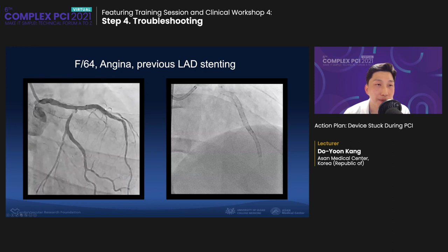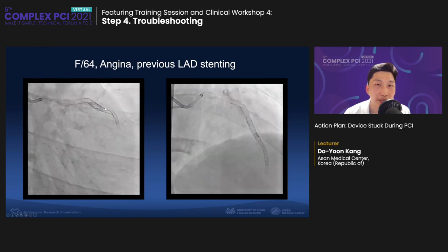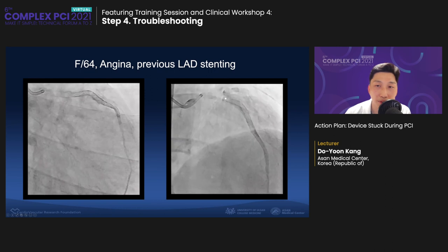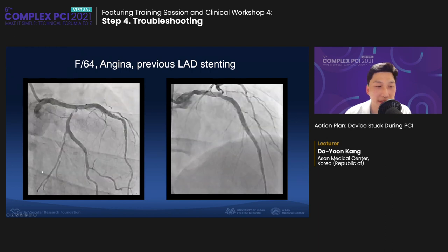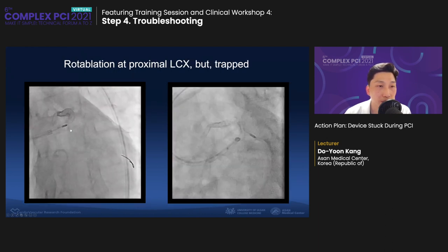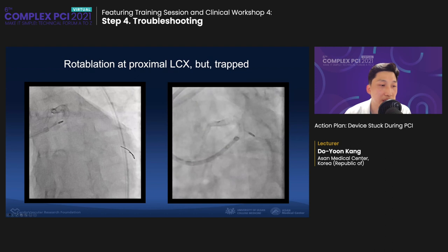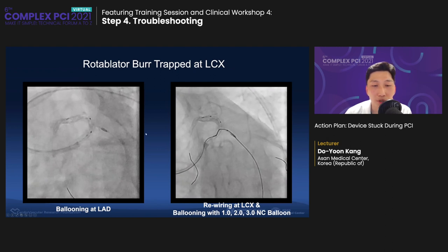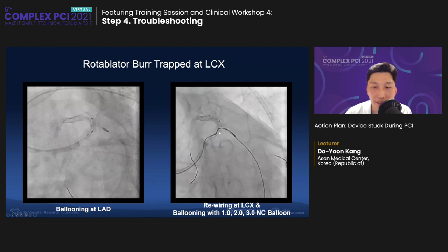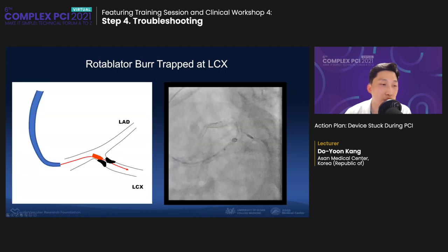Another case: a 64-year-old female with angina and previous LAD stenting of the proximal LAD, where the proximal circumflex region progressed with severe calcification. We tried to perform rotablation, but it was trapped — a very dangerous situation. We performed rescue ballooning at LAD and rewiring the circumflex with a 2–3 NC balloon, but it did not work, and she underwent emergency CABG.